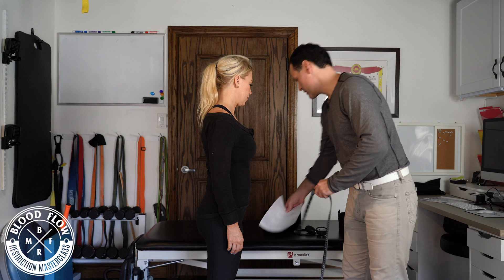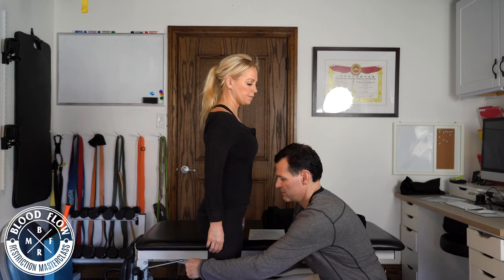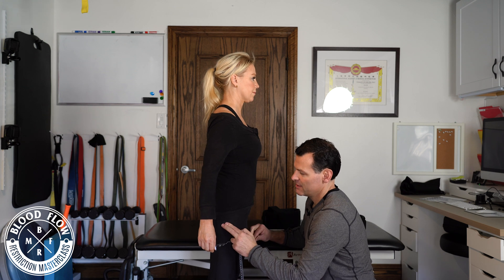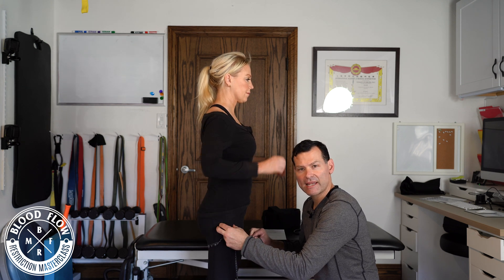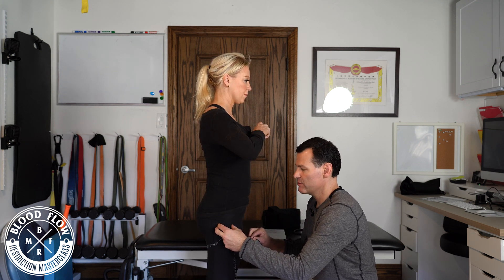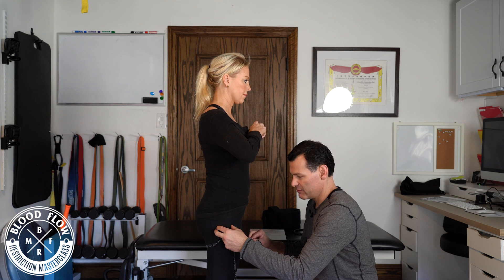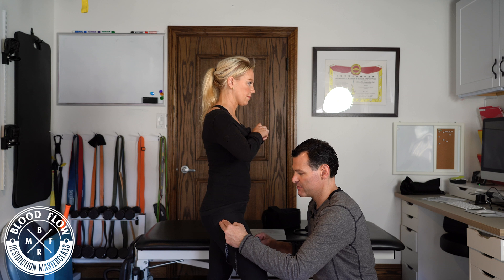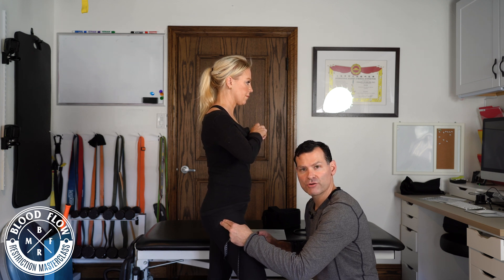Now for the lower extremity, I'm going to measure right below the greater trochanter. If I can't identify where that is, I'll have you point your toe into the ground and twist your limb in and out — move it back and forth — and I can feel that greater trochanter move. That gives me my landmark.